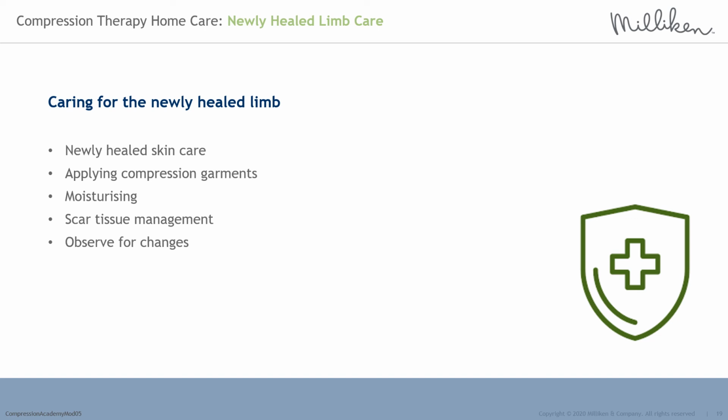Advising patients about caring for their newly healed limb. Ensure that your patient is aware of the following. That newly healed wounds are very fragile. They can take several months, sometimes years, to mature and strengthen, so may require protection. Initially, some patients have a protective dressing to wear beneath their compression stocking, and they avoid any trauma to the newly healed area. That they need to have caution when applying their compression garments.